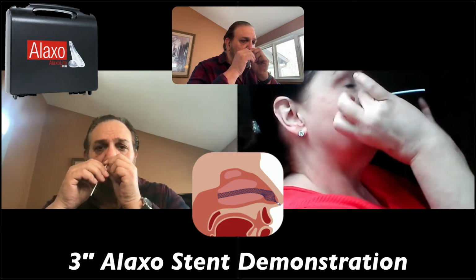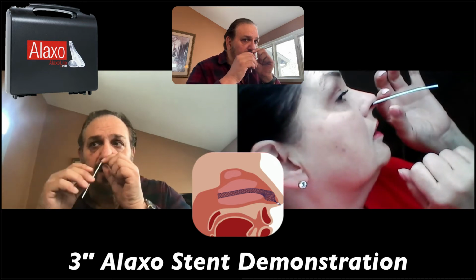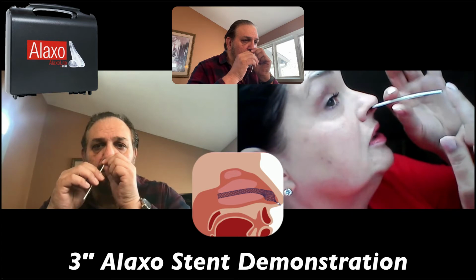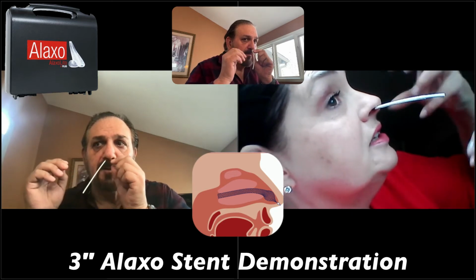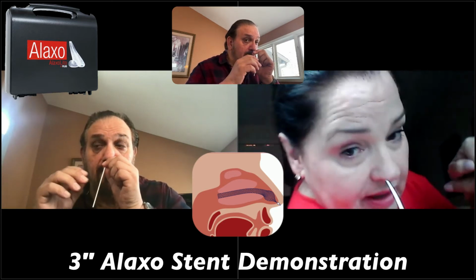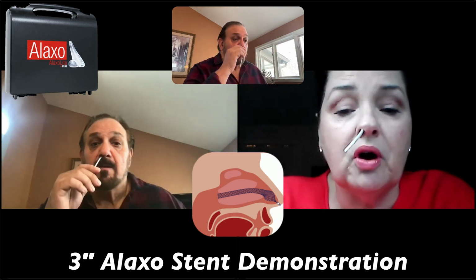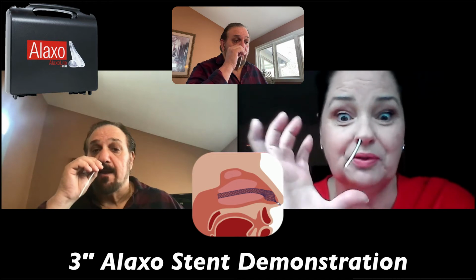So the one on the outside is what I'm pulling off, right? The one on the outside, which we call the introduction tube, because it's introducing the stent into the cavity. I'm pulling it out, but I may have pulled it out a little bit. Did I pull it out a little bit? Okay, I did too. No problem. I did the very same thing. I pulled the whole thing.